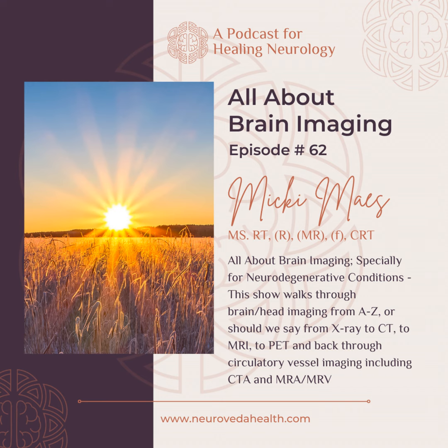Sure. First of all, I'm going to go back a little bit. I'm going to talk about NeuroQuant just a hair more. I believe in these products. They're really life-changing. But the basic sequence used for just looking at general anatomy is a T1 weighted image. So our software for NeuroQuant uses just that basic anatomic sequence that's a T1 weighted image. Now, that's run on almost every patient for any MR scan. It's usually the first scan they do. It's not sexy. It doesn't show anything fabulous, really just looking at anatomy.